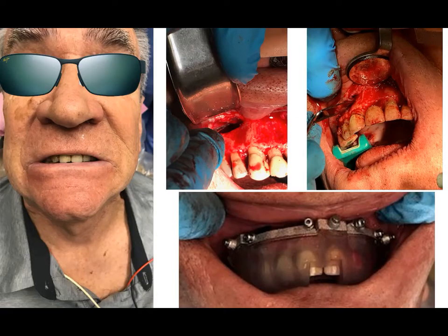We'll share some images of the day of surgery. You can see the exposure of the sinus on the patient's right, and I believe on the left as well coming up. But on the bottom image, you can see the pin guide is delivered and verified that there's a complete seat, a full seat with the windows in the anterior.